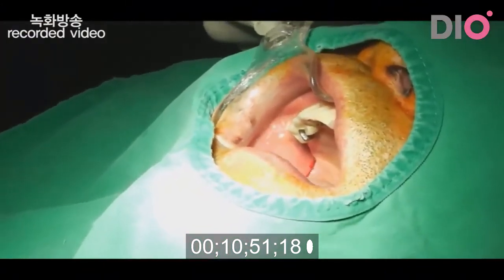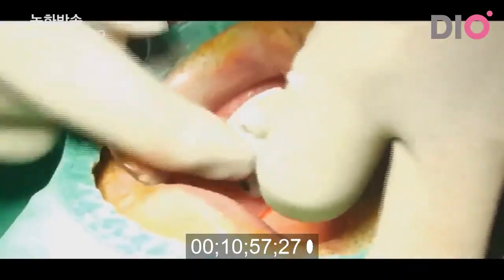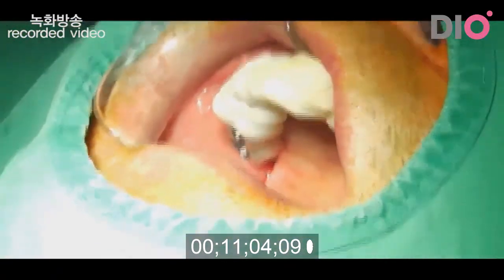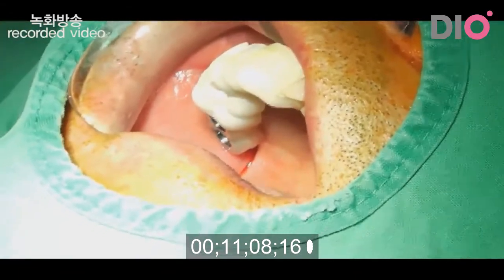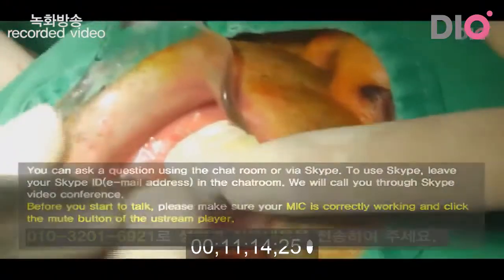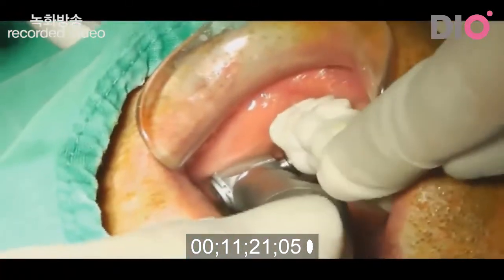and then I will use this surgical guide again. I insert this surgical guide again in the mouth, and then I will drill sinus drill again to widen the opening site in the sinus floor. So you can see it, 1 millimeter deeper, okay?